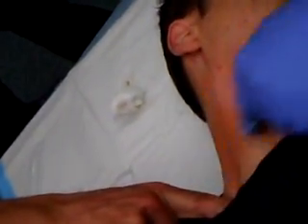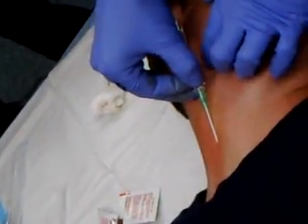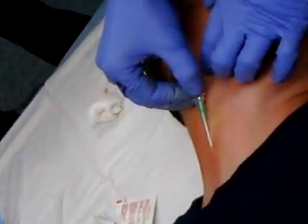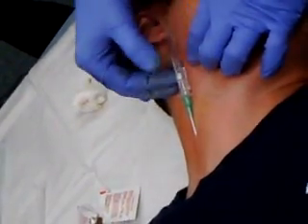Put your — take your hand off for a sec. Interesting. You're going to feel a little stick. Okay. Now, I felt it go past the skin, and I'm not really in the vein. Very good. Oh God. That was a pop.